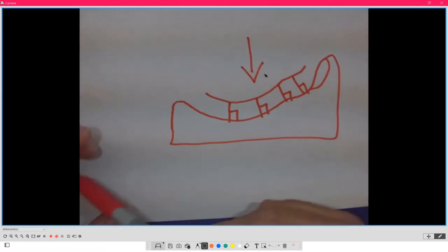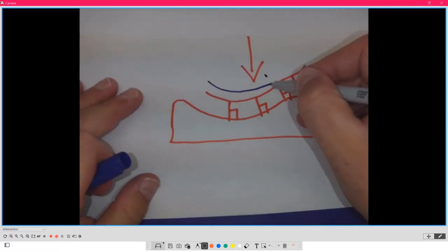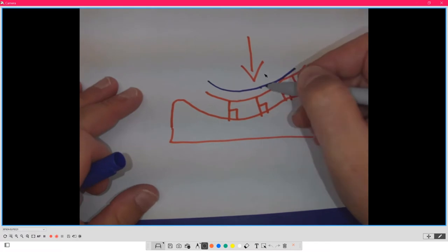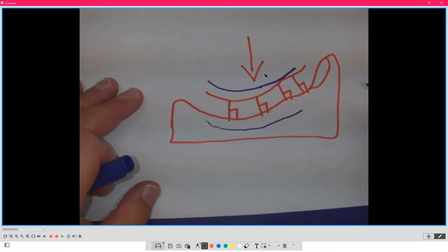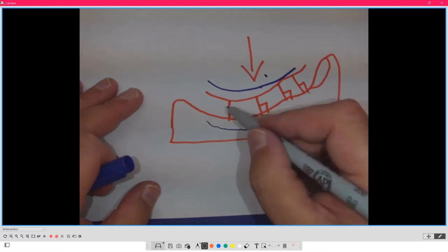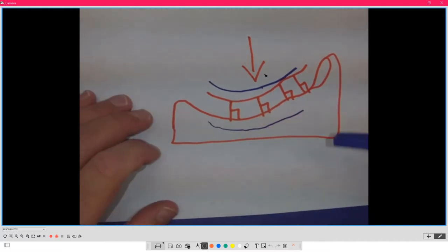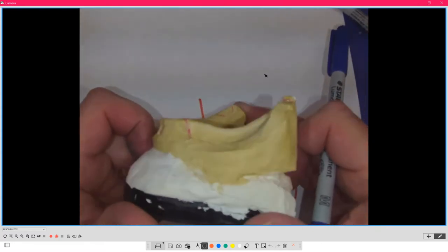If, for example, I used a 20 degree template, I can't guarantee that 20 degrees is hitting that ridge in the same manner. You can't. So I do a customized curve myself. I eyeball that based on the shape of the ridge.